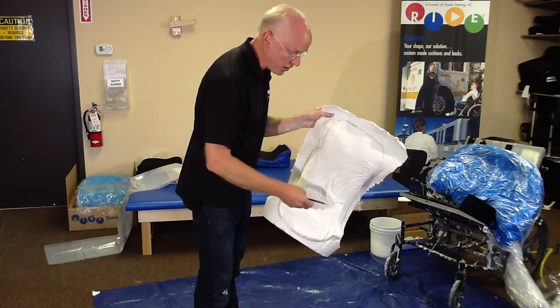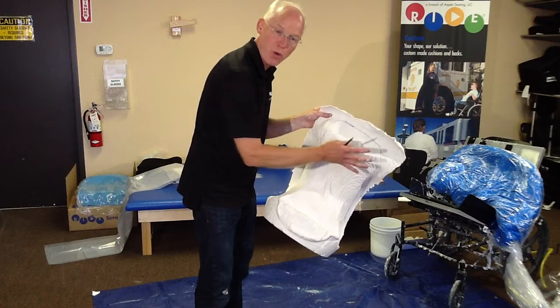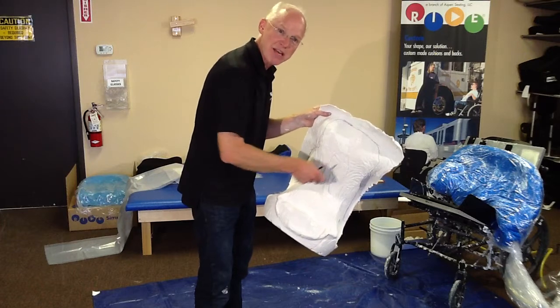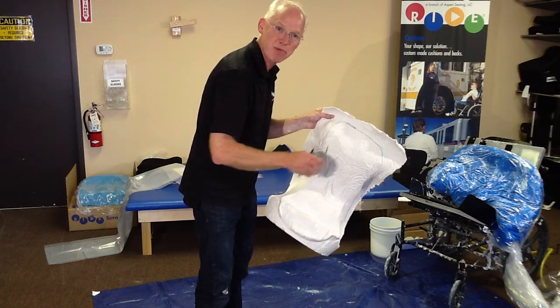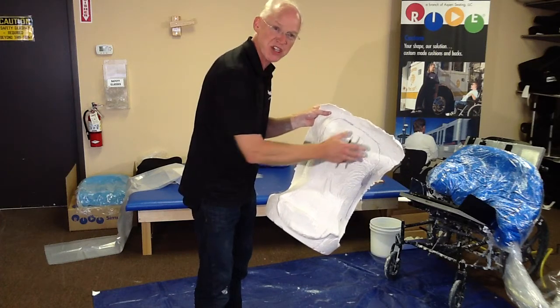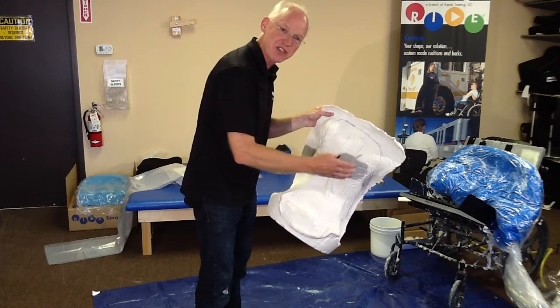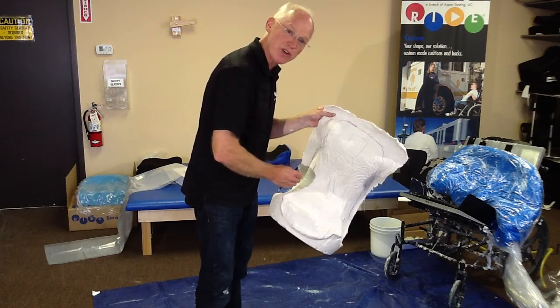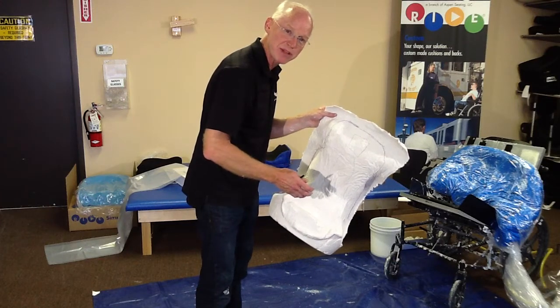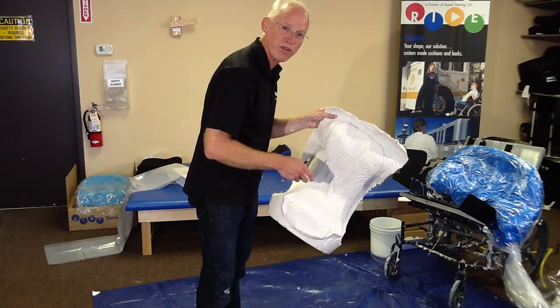This will also be your opportunity to identify any areas that are at high risk, such as a gibbous deformity or a rib hump or spinous processes, that you could actually circle and document on the order form for an enhanced relief to take pressure off of high risk areas. You can mark where you might want the headrest, especially if it's off of midline. You can mark on the cast if your trunk midline is different from wheelchair midline. You can give us a wheelchair midline on the cast as well too. That'll make sure we put the platform for the hardware in the right place. Lots of things to consider. Don't make it too difficult. It'll all come into place as you work through your individual clients.